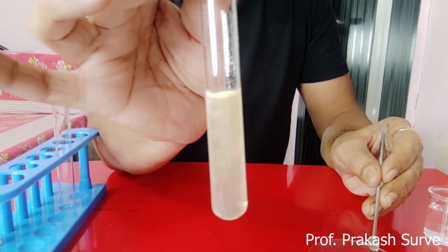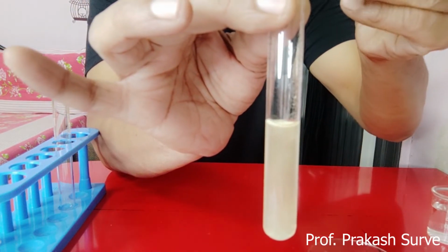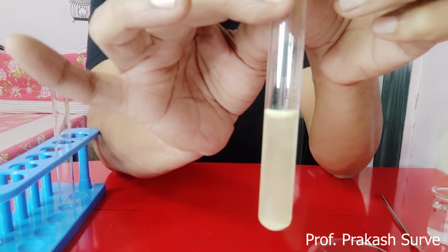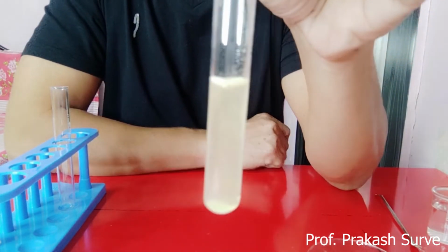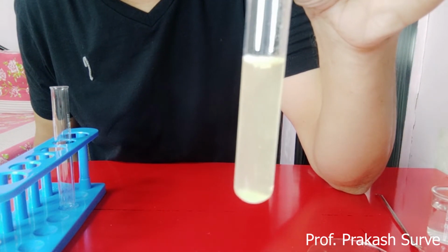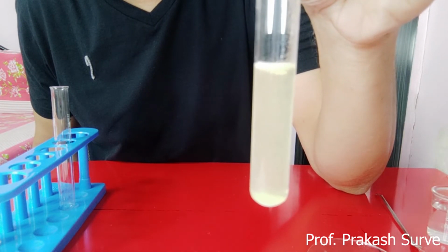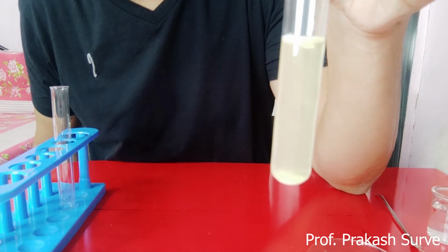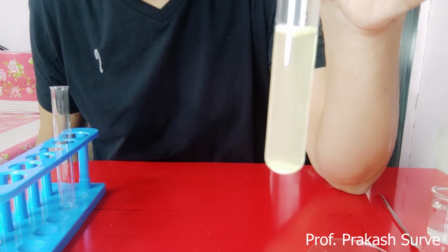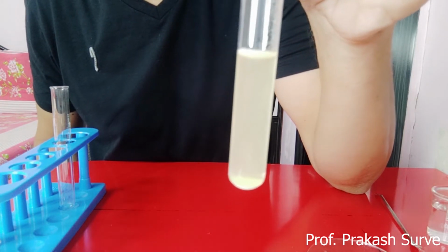So what we observe here is that the sulfur powder sinks down. This is the urine sample we are testing. You can check how this sulfur powder is going down. Slowly all the particles of the sulfur powder are going down.